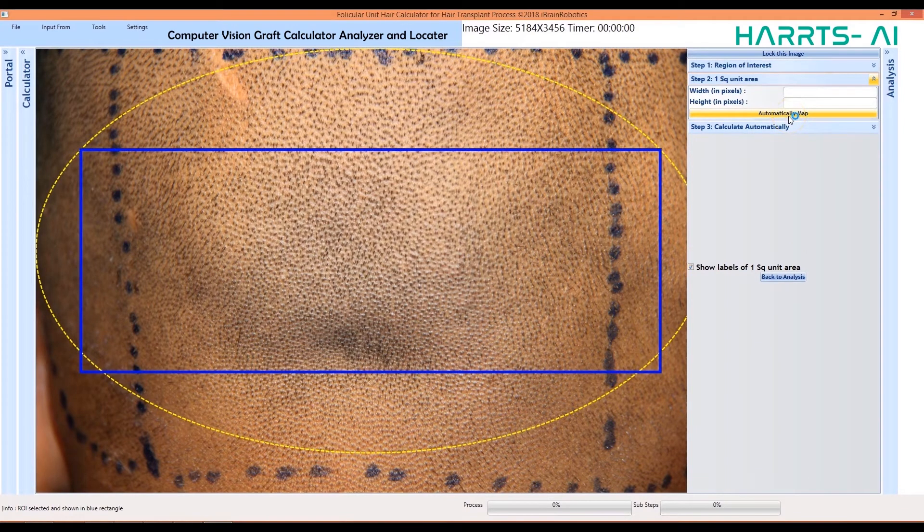Now, define one square unit area in your area of interest. You can either define it manually by entering figures in the boxes, or you can define it automatically.